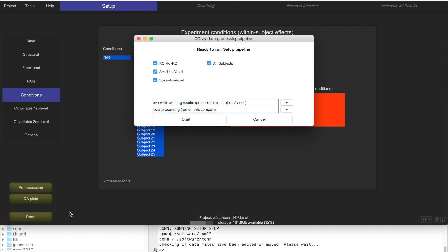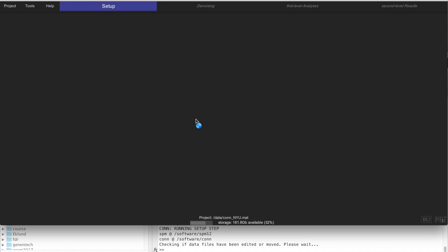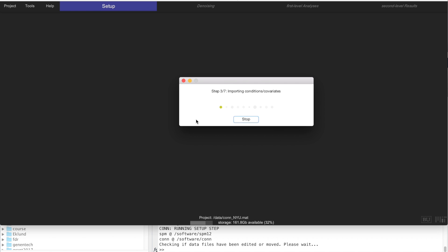To do that, we just click Done and then click Start. This is going to perform a little bit of erosion on your white matter and CSF mask, extract the ROI signal for each subject for all defined ROIs, and get all data ready for denoising. This process takes less than a minute per subject, so in this case about 15 minutes total. Let's skip ahead to the denoising step.